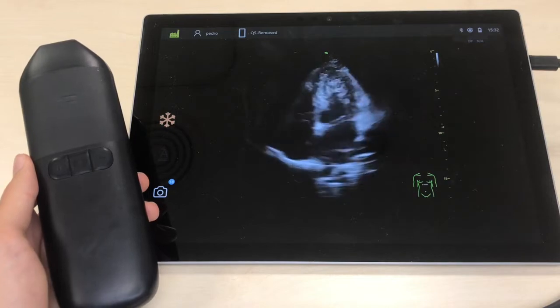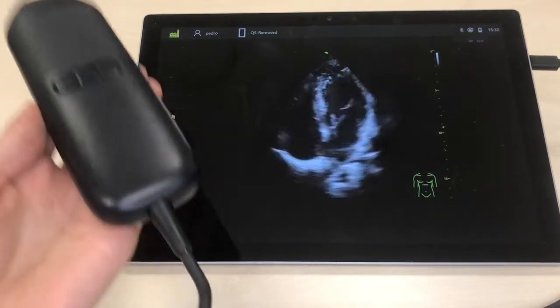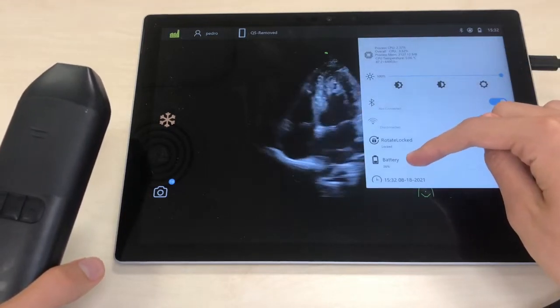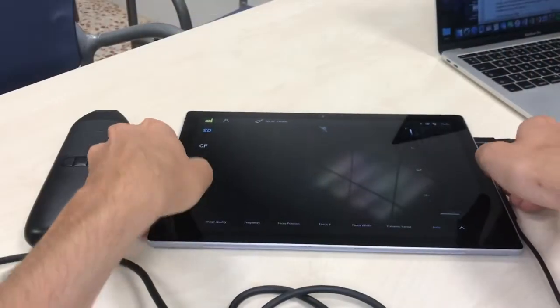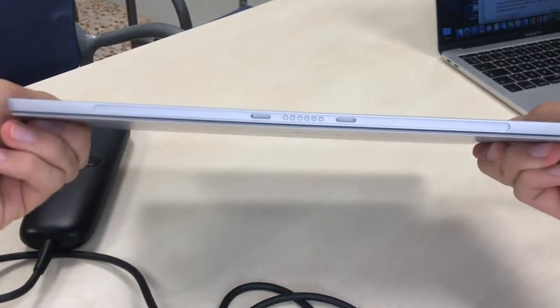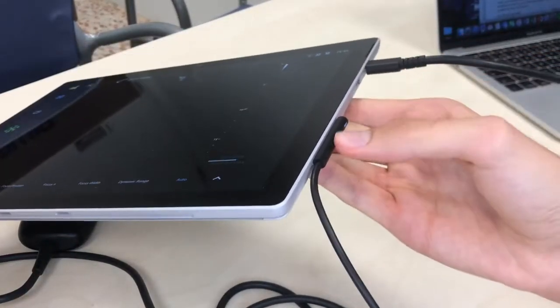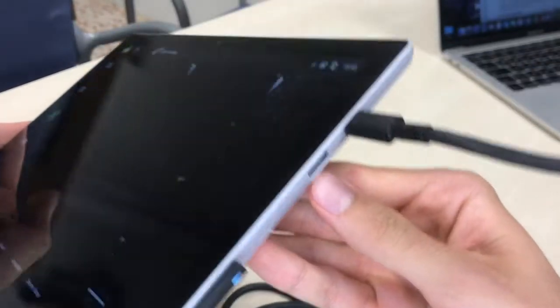Starting from the outset, it is lighter than other handheld devices mainly because it doesn't have an integrated battery, but instead it powers through the tablet's battery. This allows extended scanner autonomy, less heating, and longer scanning sessions. Additionally, it can still be used while it's charging through this port, allowing for a whole shift of continuous scan time.